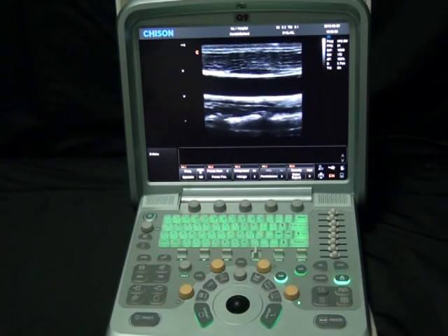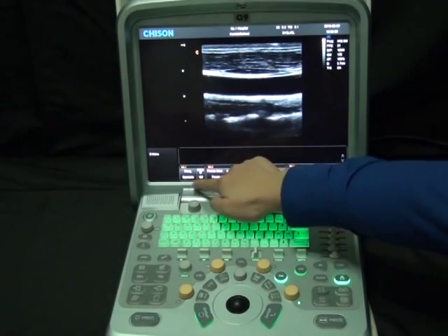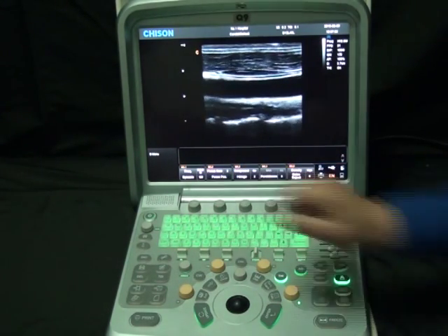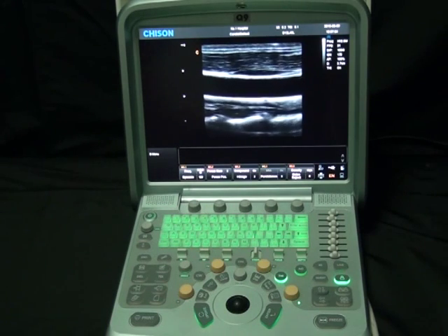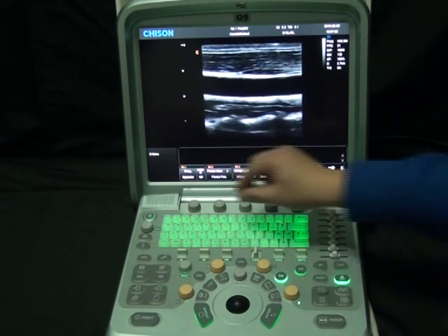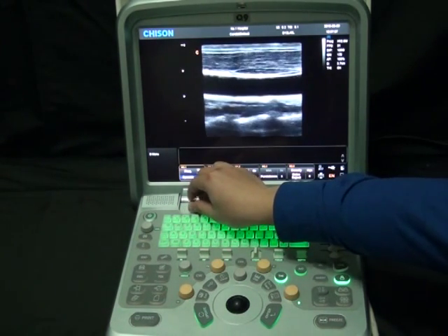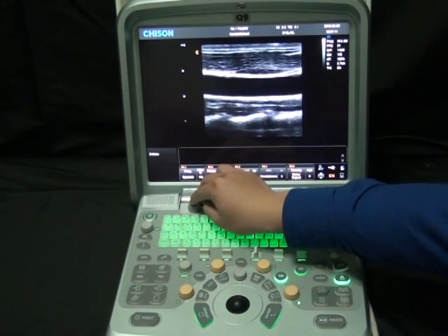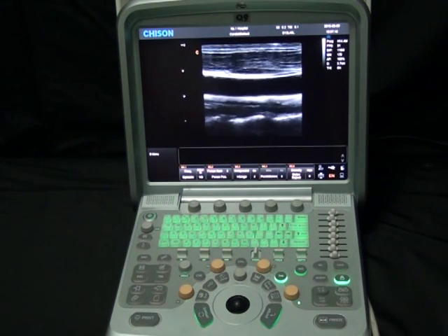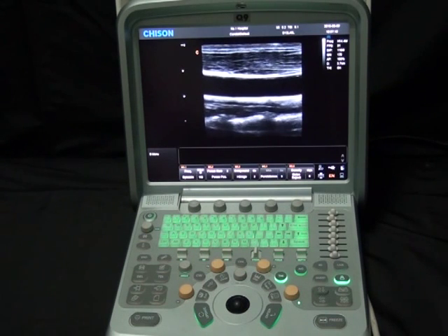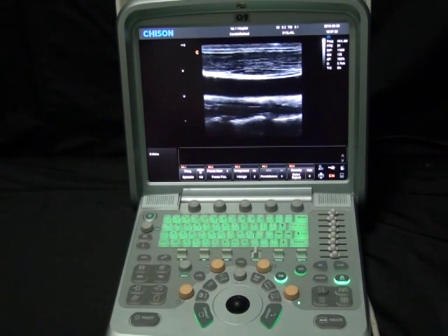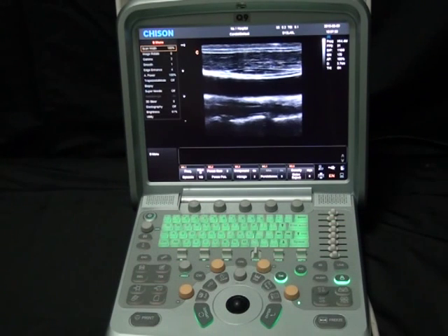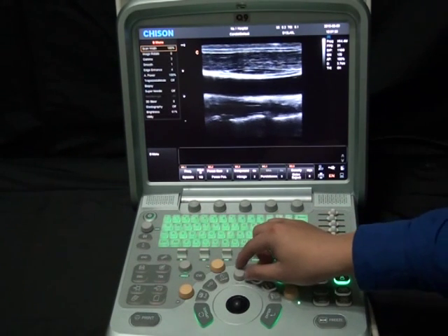Up top, we have our image optimization controls: frequency, dynamic range, and as shown, twist and press the knob to get different values. For example, press the button to change the frequency and twist the button to change the dynamic range. We have some secondary image optimization controls by pushing down the menu button. On the top left side of the screen, several other parameters are available.